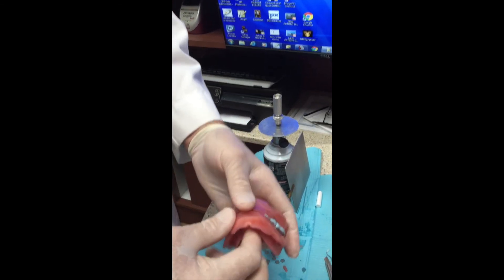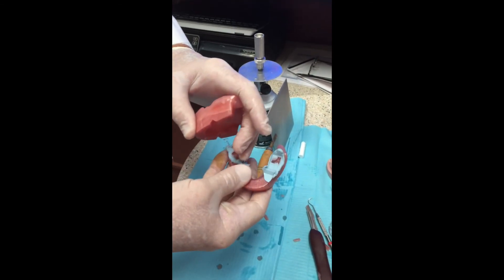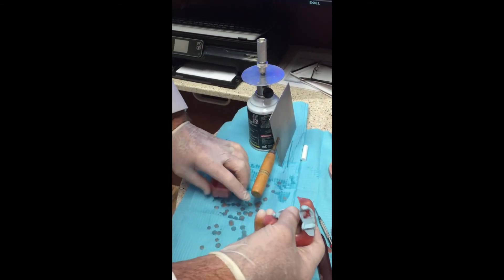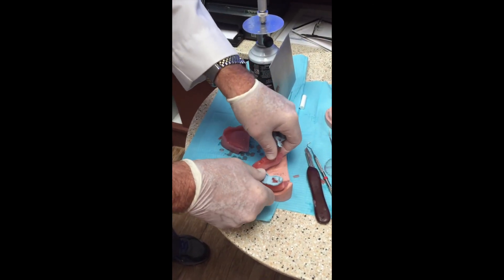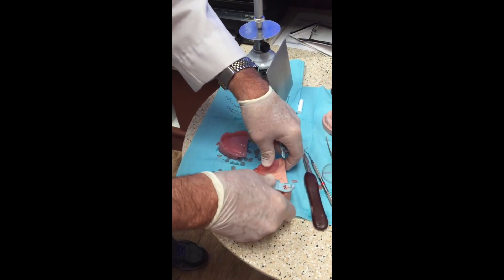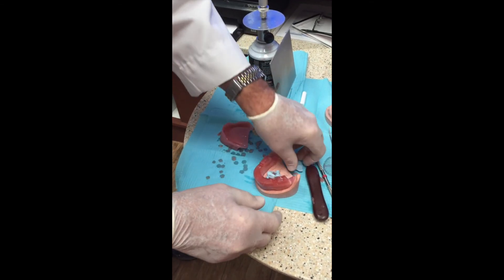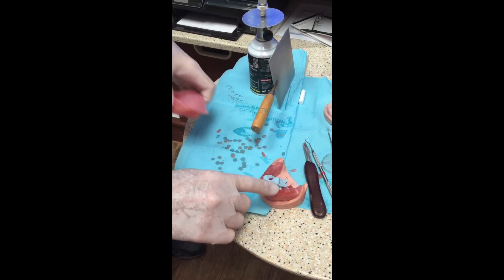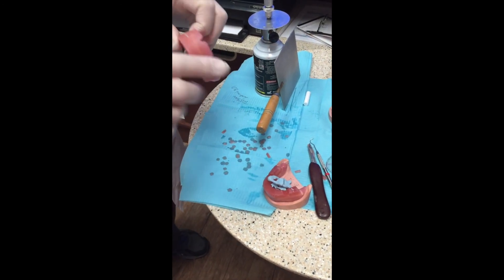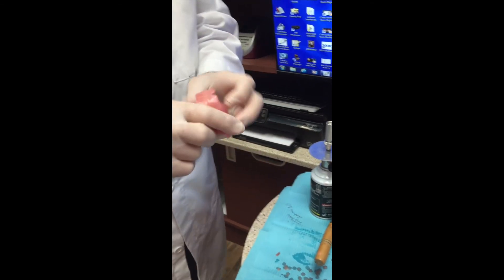Now we have our centric relation bite and we're going to take this loose. It's very important to keep up with these bites — they can get lost in shipping. I like to go ahead and put them back onto the models. This is a locator overdenture, and we'll put the bites back on there. I've had cases where this bite got missing, so it's very important. Remember we Vaselined the upper denture for a reason — we're going to put an extra coat on it, and then we're coming over to do a face bow transfer.